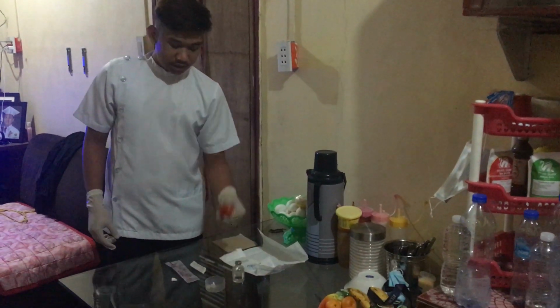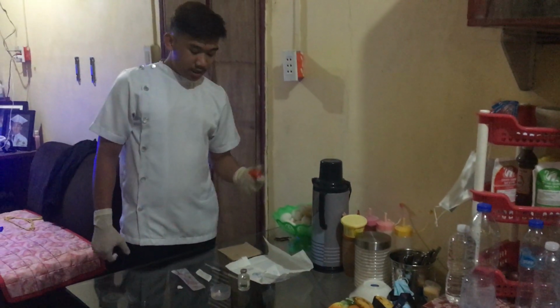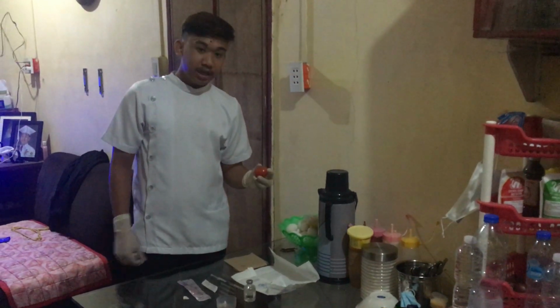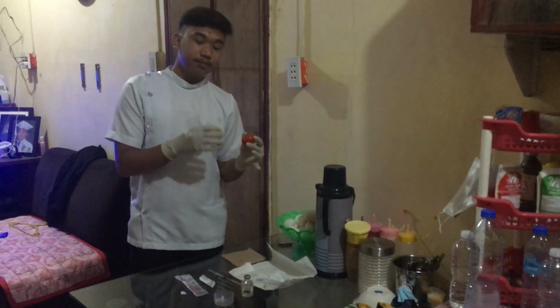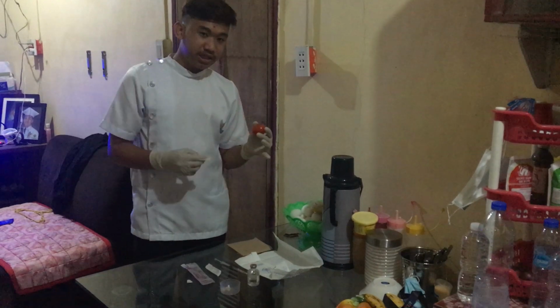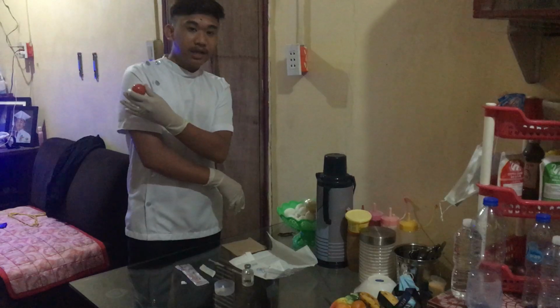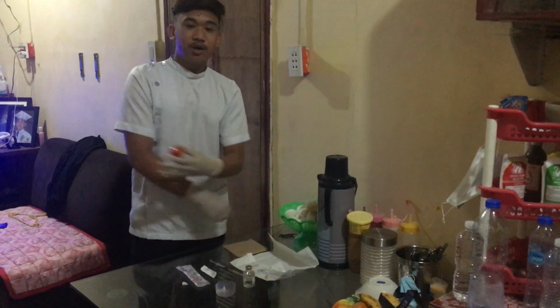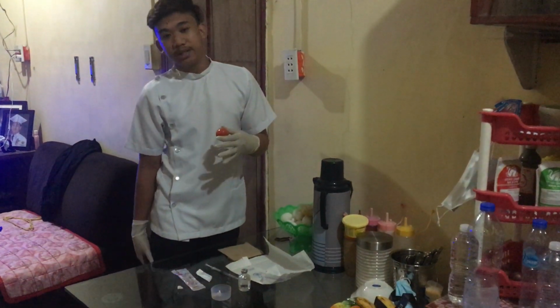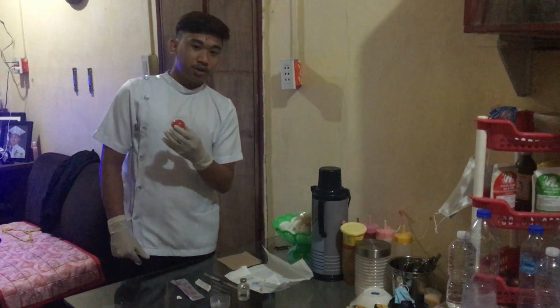First, you're going to get the tomato. This will act as the patient or the arm of the patient. There are many areas of the body where you can inject subcutaneously: the lateral part of the arms, the abdomen, both sides, and the lateral part of the thigh. In my case, I'm going to inject it in the lateral part of the arm.